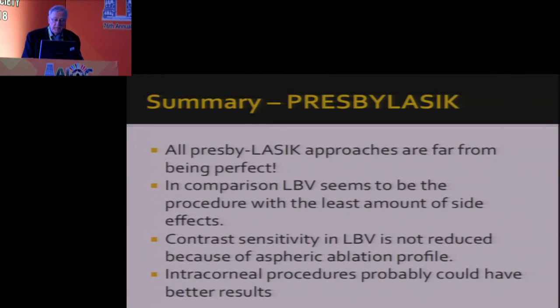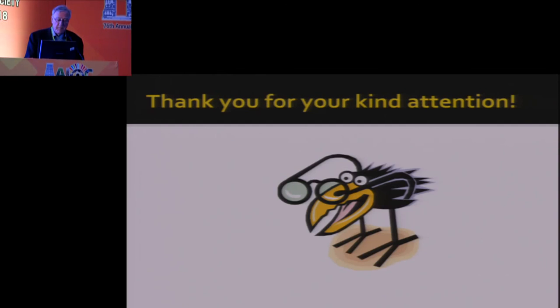In summary, all Presby LASIK approaches are far from being perfect. In comparison, laser blended vision seems to be, at the moment, the procedure with the least amount of side effects. Contrast sensitivity in laser blended vision is not reduced because of an aspheric ablation profile. Intracorneal procedures probably could have better results.